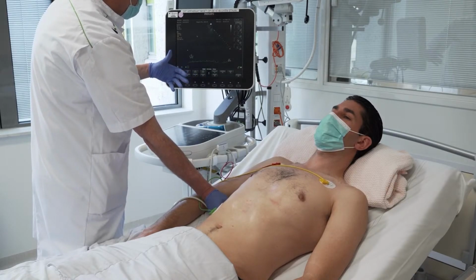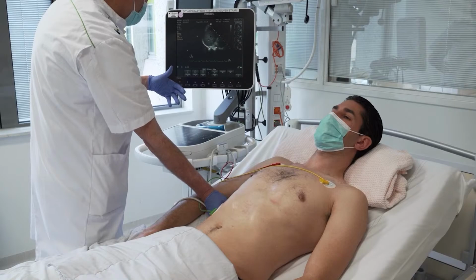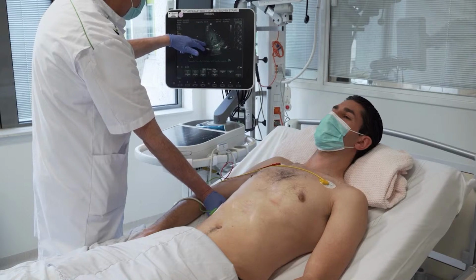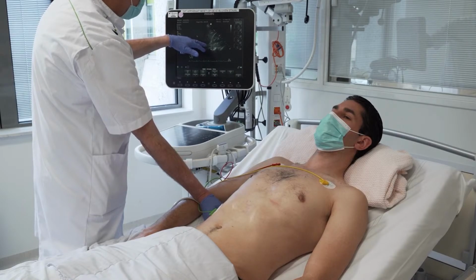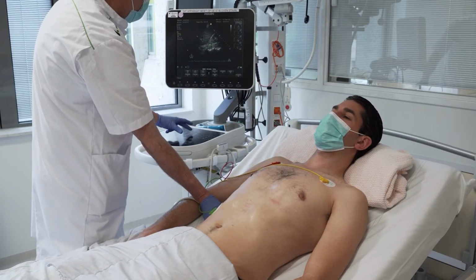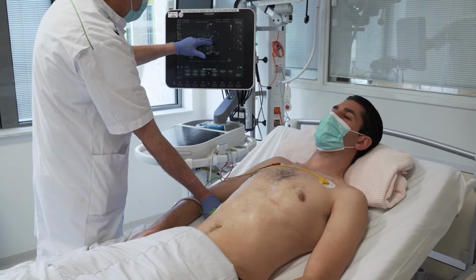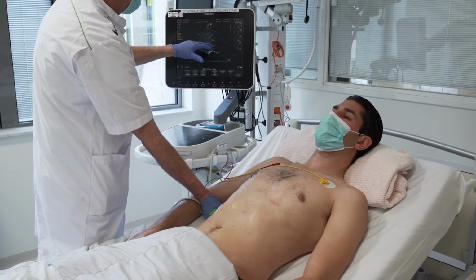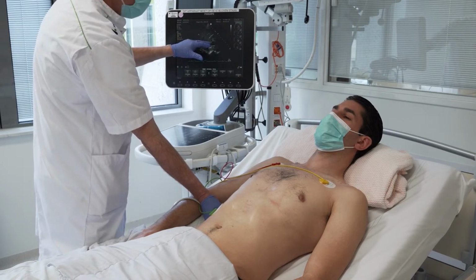If patient has free fluid in the abdomen, let's see, I'm going back to my diaphragm, you will see subphrenic fluid, or if I go even more caudally, I am now arriving at the kidney. This is Morison's pouch, and I will see free fluid between the liver and the kidney in Morison's pouch. So this is an important landmark for free fluid in the abdomen.